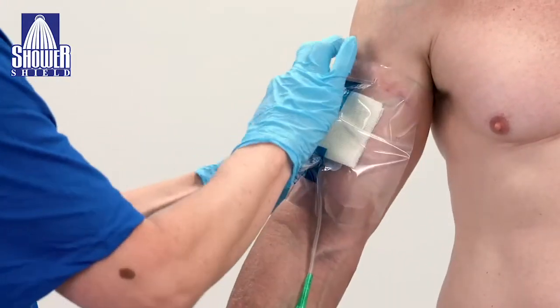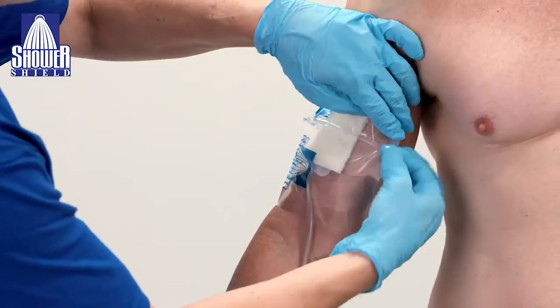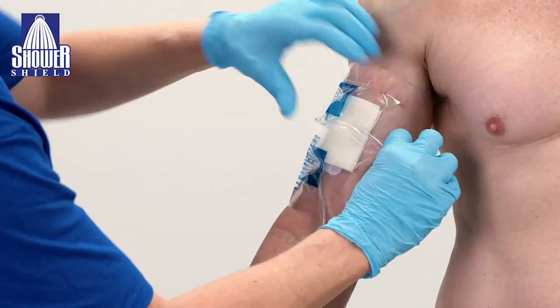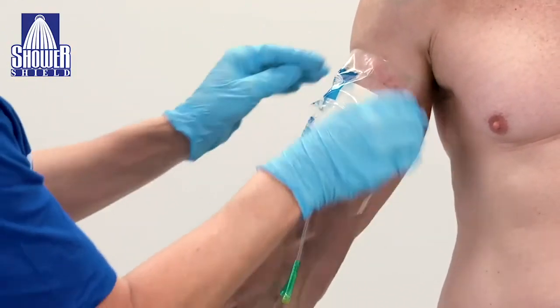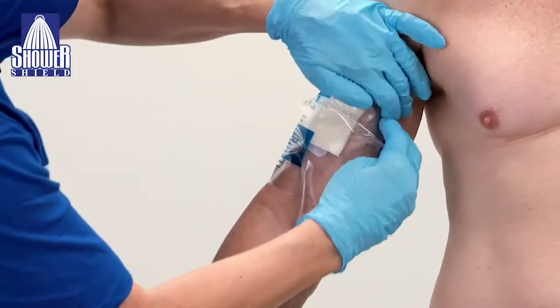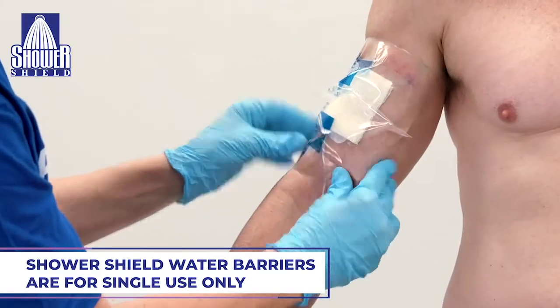Using the excess material on the right and left sides, apply using the pleating technique or the hinge technique. This will create a tent and will allow for full articulation and flexibility while the patient showers. Ensure that all borders are completely sealed. Do not reposition or reseal after initial placement.